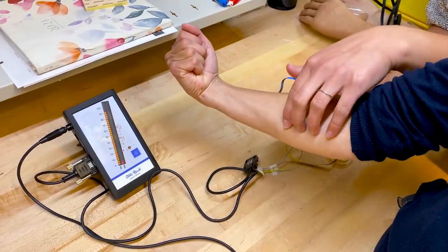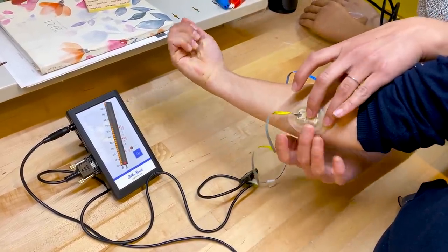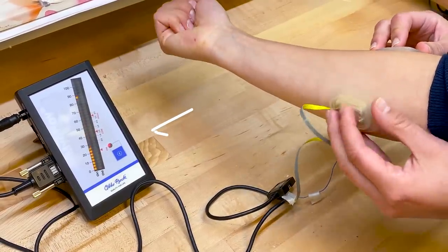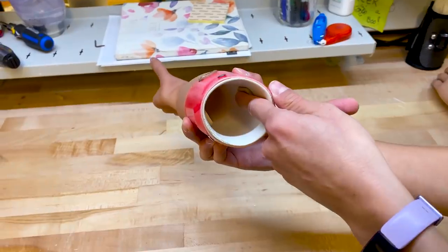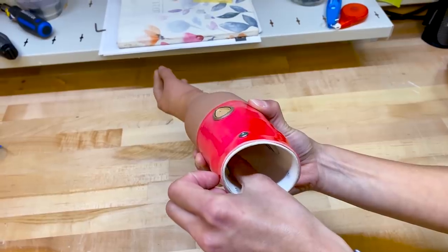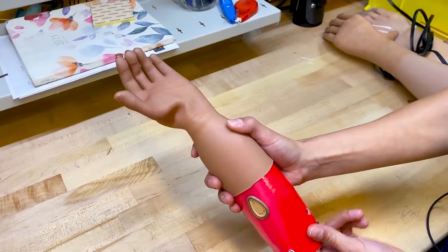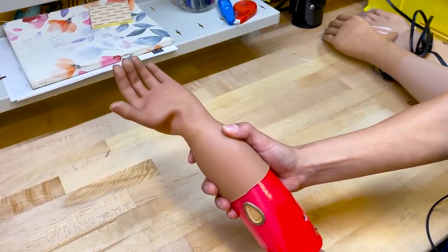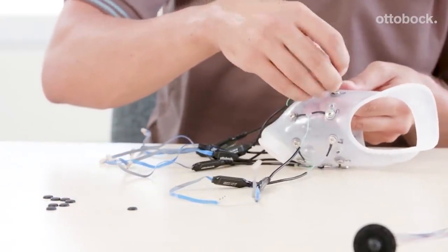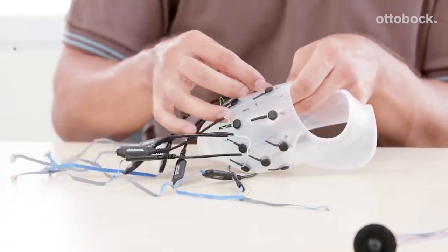When a person is being fitted for a myoelectric device, the prosthetist will find the best place for the electrode. And then they test the strength of the signal to make sure that it can be detected by the device. Then the electrodes are placed into the prosthetic, and you can see how the hand is responding as the electrodes sense movement. Now, of course, it's going to be much smoother when a person's actually wearing the device. Depending on the device, this can become quite a complex process.